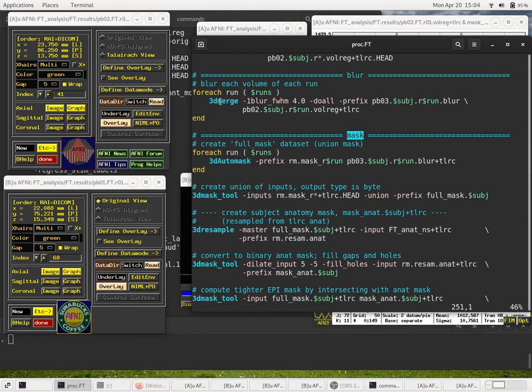And why do we blur? We blur for two reasons. One I've talked about already, just in the resampling step. We blur so that by combining neighboring voxels a little bit, you hope to get some noise cancellation and hope to make the signal a little more clear, and to possibly give you more clear results that way.